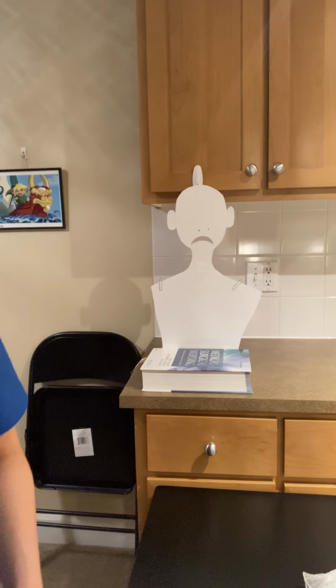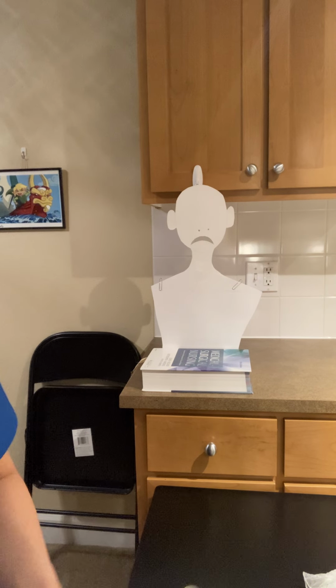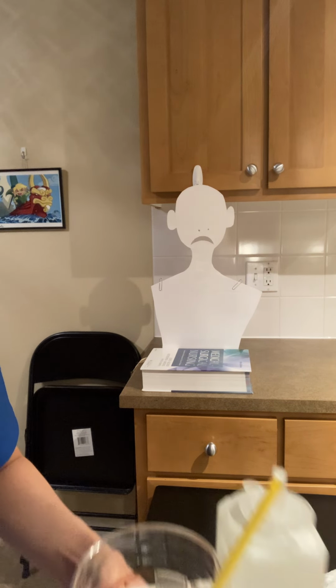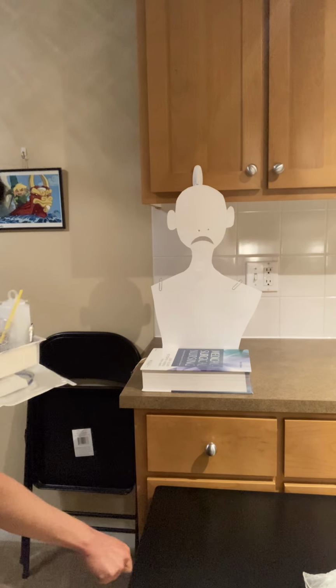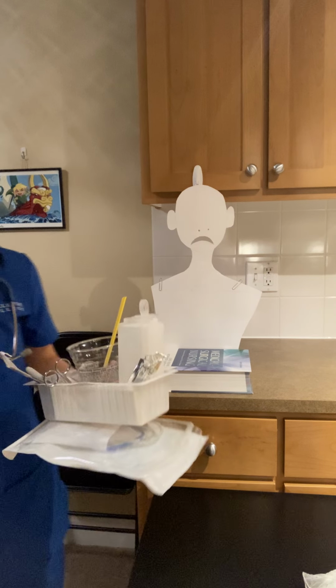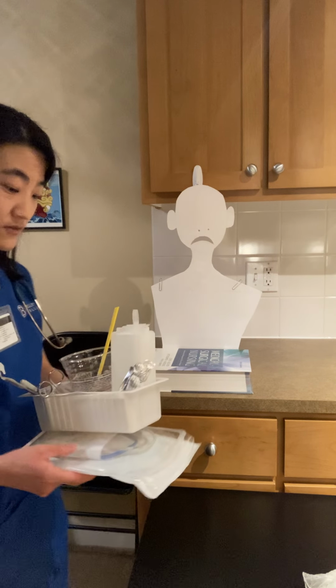So I have already confirmed with the patient history that he does not have any contraindications to getting a nasogastric tube placed. So when I enter the room, I'm going to close the door to give him some privacy.